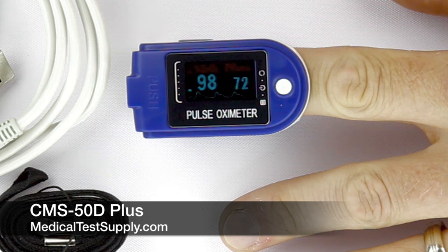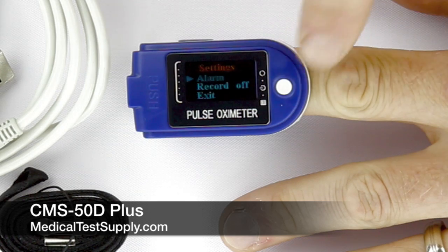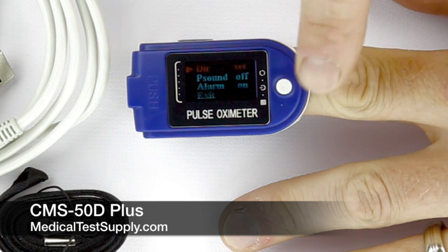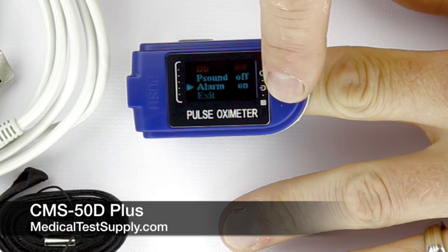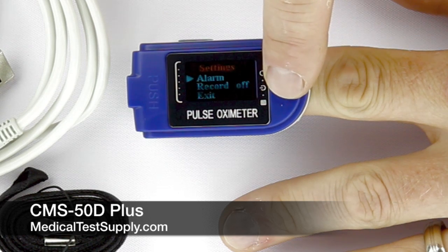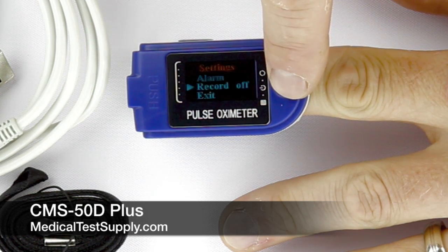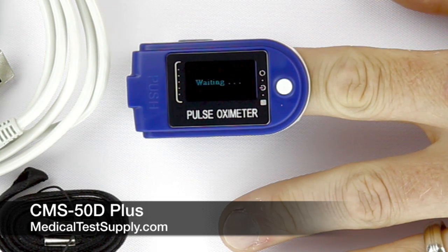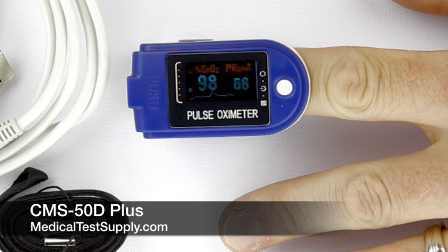You can view both the oxygen saturation and pulse rate and orient those for the best viewing. The operator can scroll through various menus that control the alarms, pulse rate sound, display brightness, and recording functions. The menus also control the upload function and reset of the memory after data transfer. Alarms are adjustable for oxygen saturation and pulse rate, programmable in both high and low limits. When the device is in recording mode, a small indicator will flash on the right-hand side of the display.